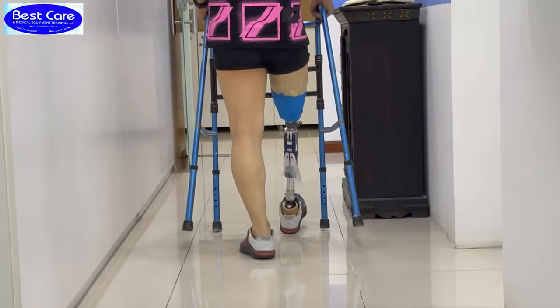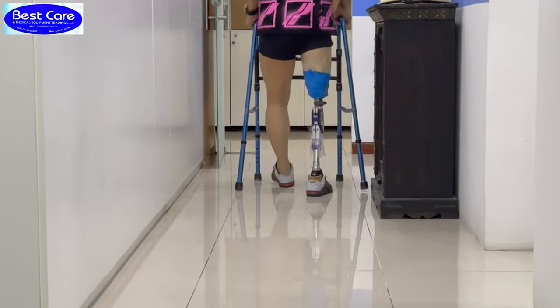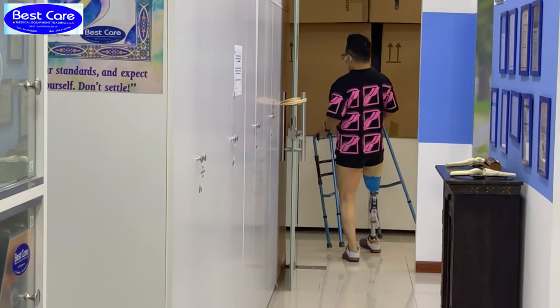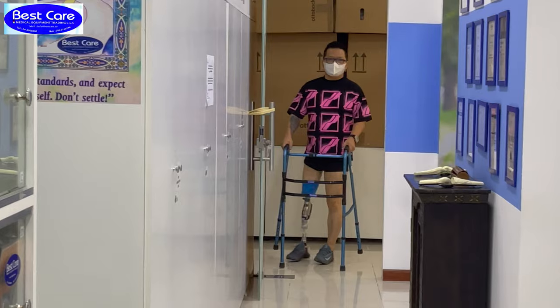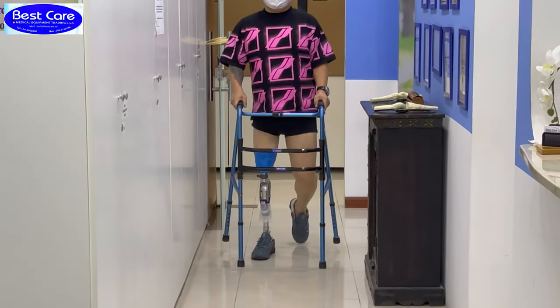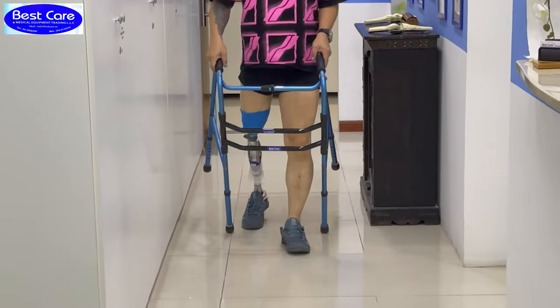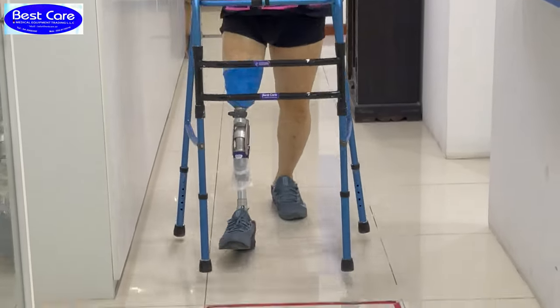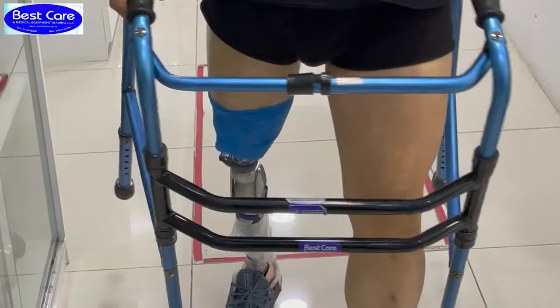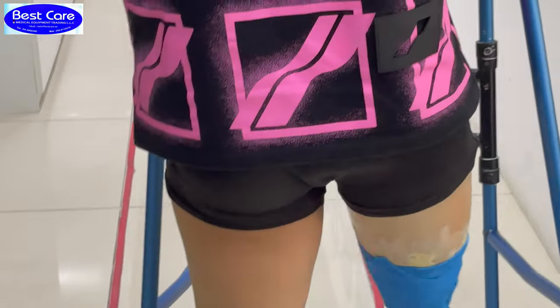Always consider one important point: the adjustment and alignment for the extension and flexion. In the first day of the trial, you have to put it to the factory setting and make it completely zero, and slowly while your patient is walking, you can adjust.